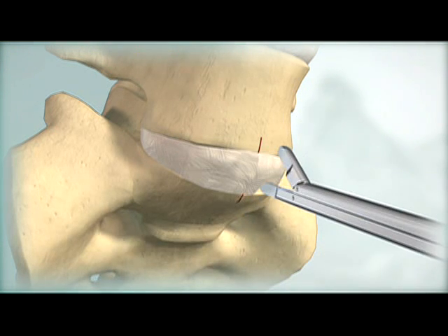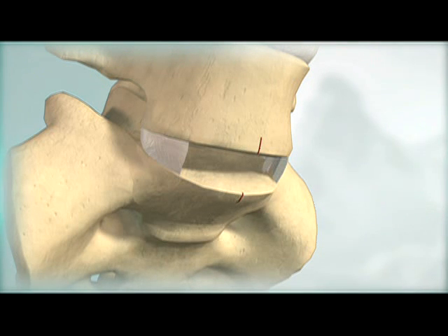Perform a thorough discectomy using the bone elevator and standard rongeurs, Kerrisons, and curettes, ensuring the posterior lateral corners are free of disc material.